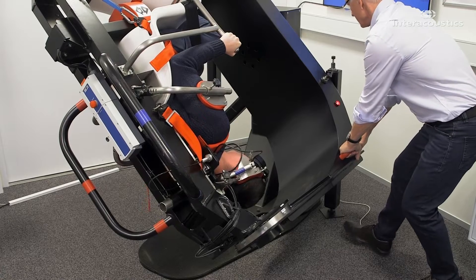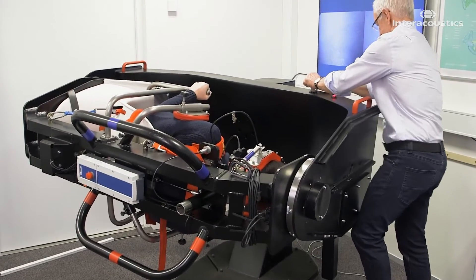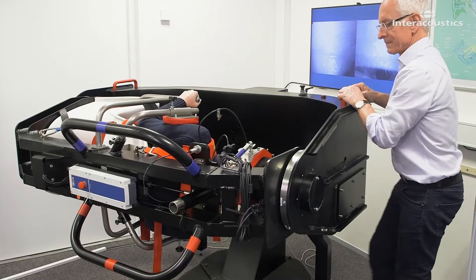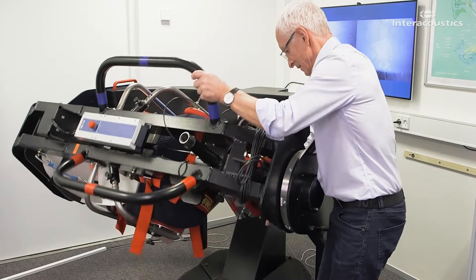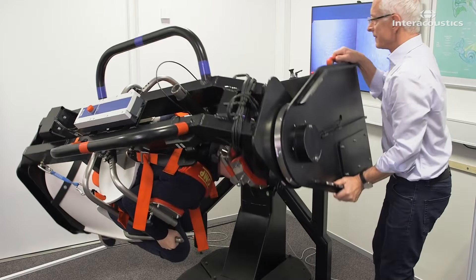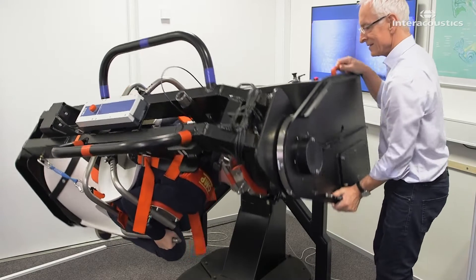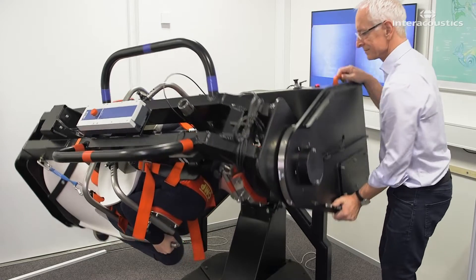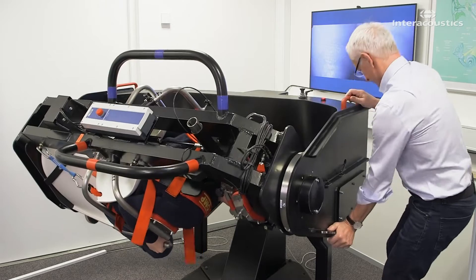In the sixth position, raise the main arm 45 degrees. Lock the augmented stop arm in its upward position, and rotate the secondary arm 45 degrees over the unaffected ear. Apply 12 rapid decelerations.